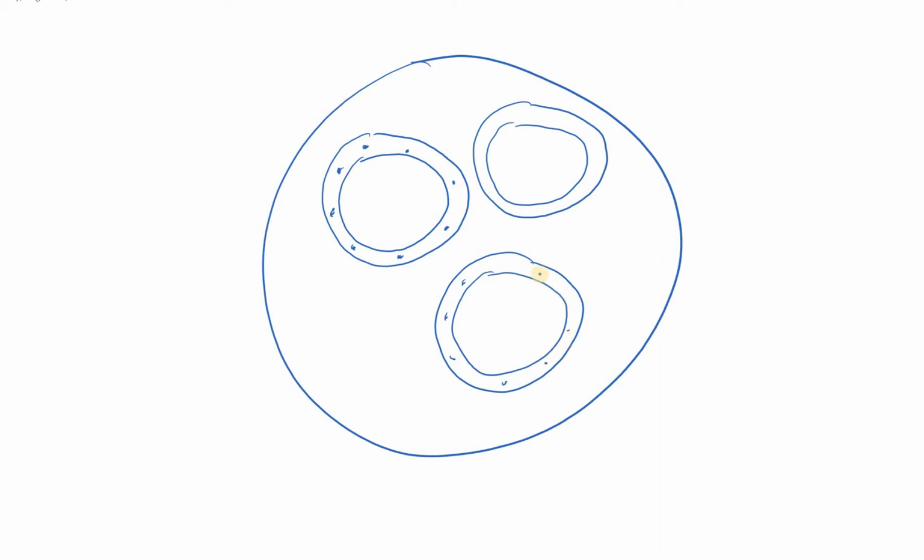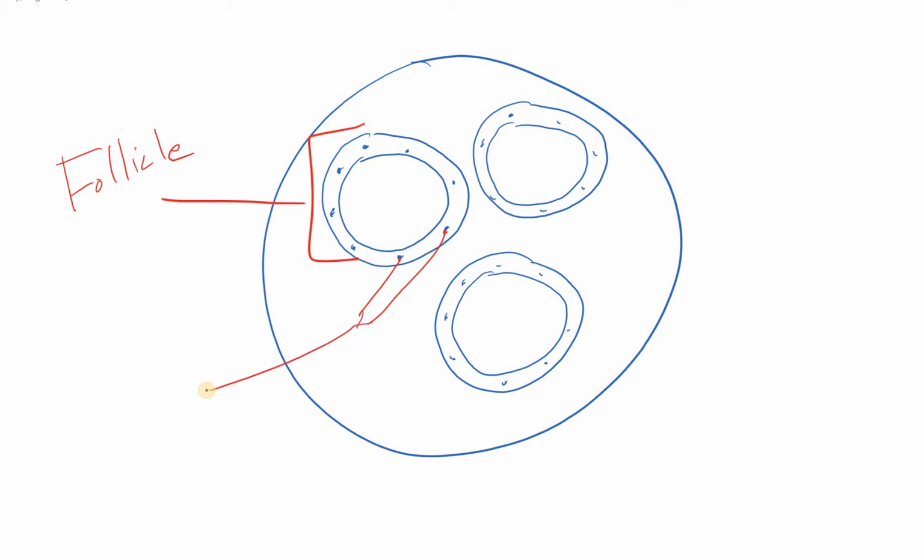And another follicle with follicular cells. Okay, so this whole thing there is a follicle. And these would be the follicular cells.